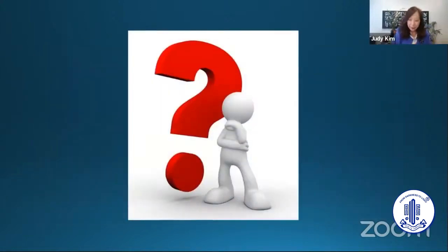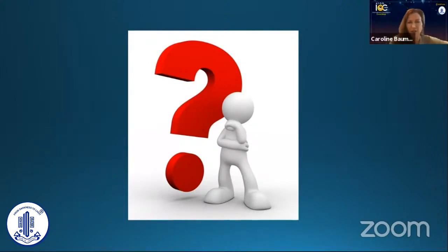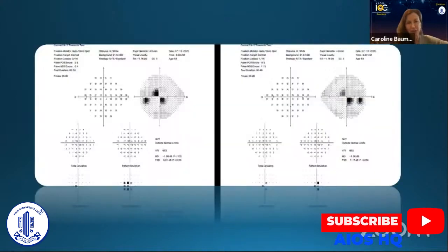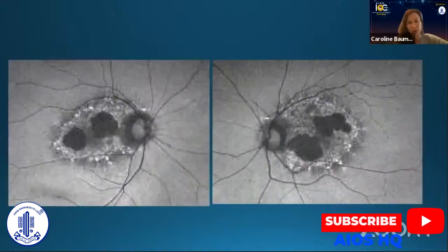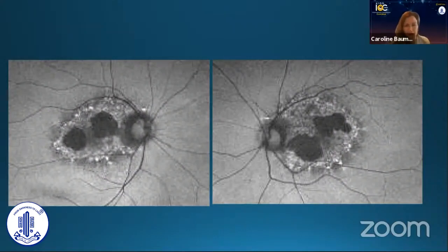So what's going on here? So, Judy, yes. I think it's really interesting when you go back to the autofluorescence. If there weren't those areas of geographic atrophy, you would think this was a pattern dystrophy, or maybe not exudative AMD, but some sort of dry AMD mimicker. Without those big atrophic areas, I would say, oh, this is a pattern dystrophy, and I would ask about a family history. But the one thing that you pointed out that is really interesting is that when we see something like a pattern dystrophy or something genetic, both eyes are usually mirror images. They're very, very symmetric. And these are not mirror images. They have the same pattern in each eye, with a spot up to the right and a spot down to the left, which is kind of atypical, I think.